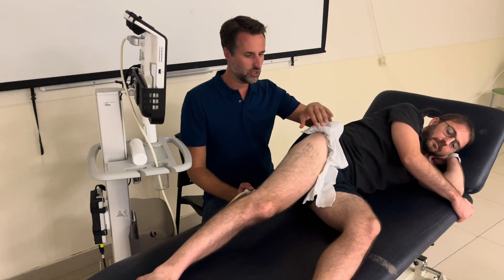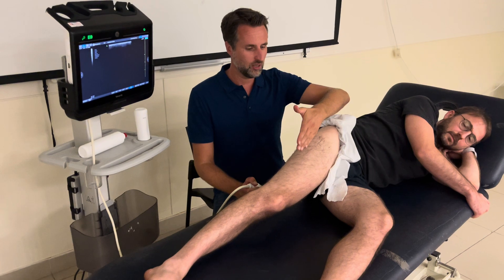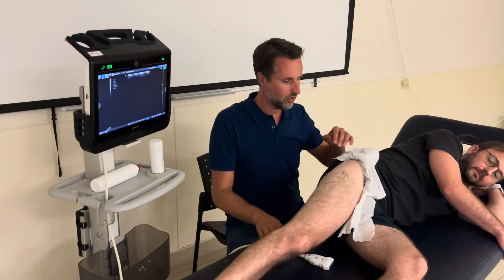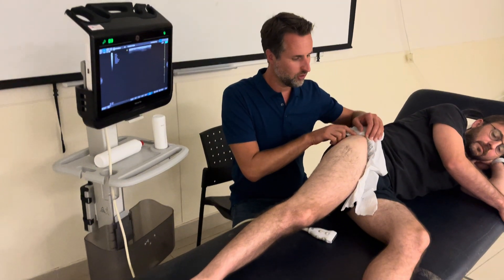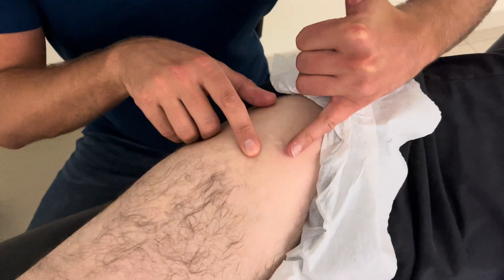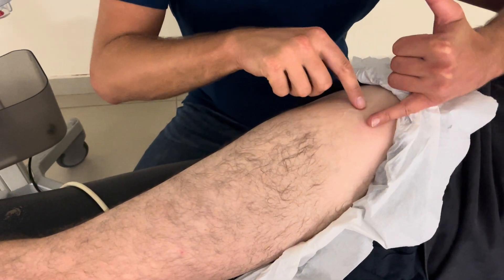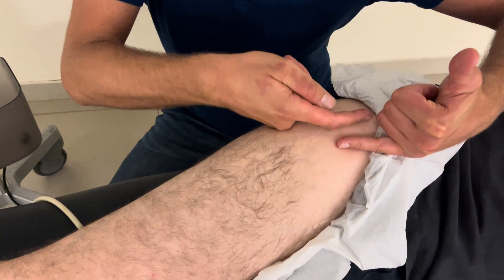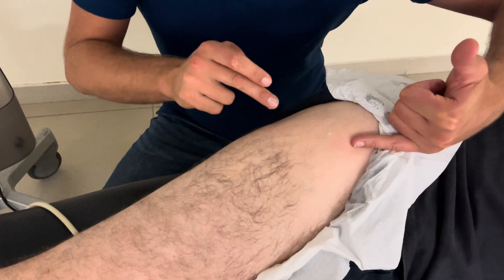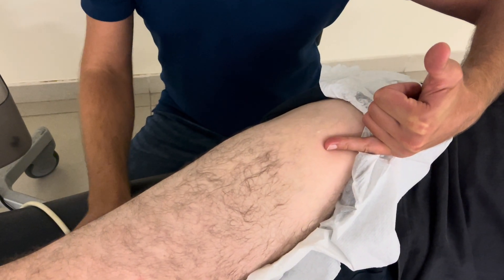We're going to scan the lateral hip, but we first have to realize something about the angulation of the tendons. The different tendons come along on the greater trochanter. The first one is the gluteus minimus — this is the insertion side. From the midline of the leg, the minimus attaches about 10 degrees anteriorly. That's important for later when putting your probe on in the long axis view.